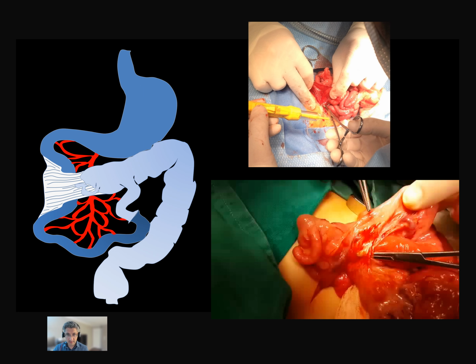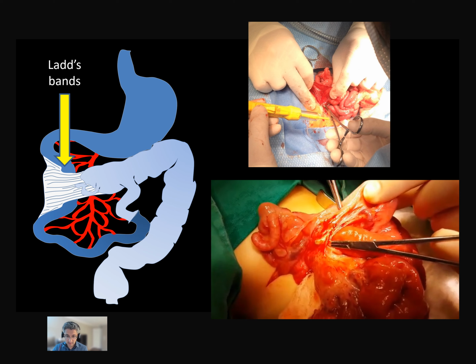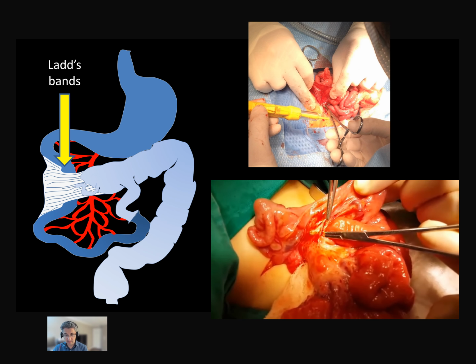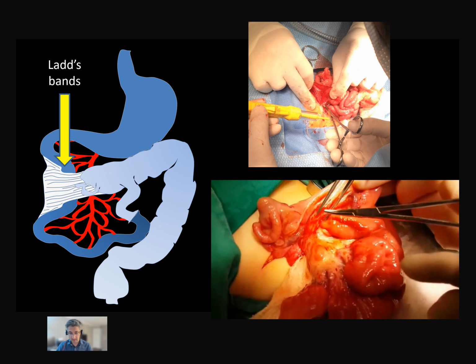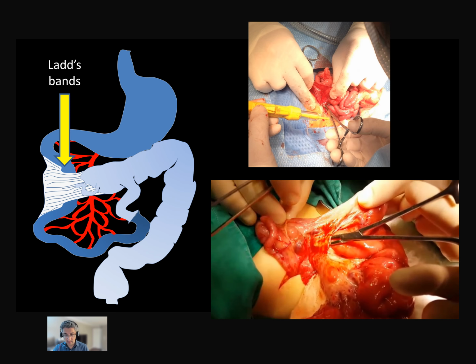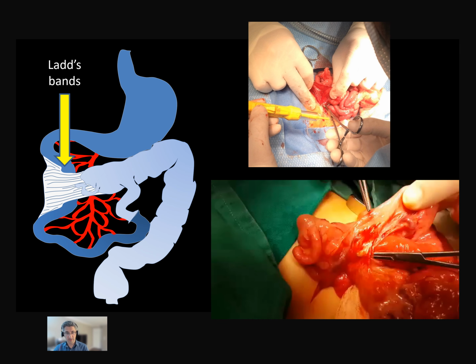And here at surgery you can see it. These are the Ladd bands. They are transparent, very thin. We cannot demonstrate them on imaging, but at surgery, as you can see here, they need to be resected. You can see here, they are causing obstruction.